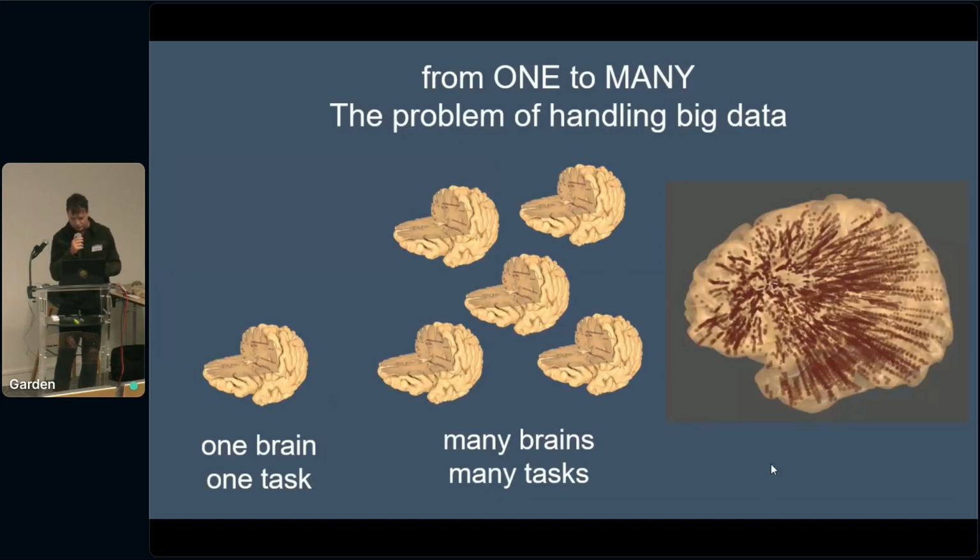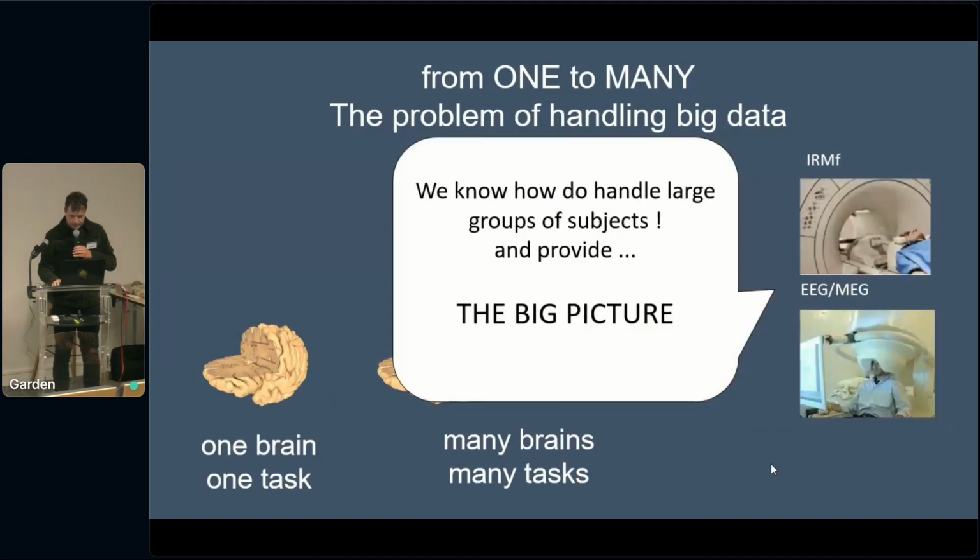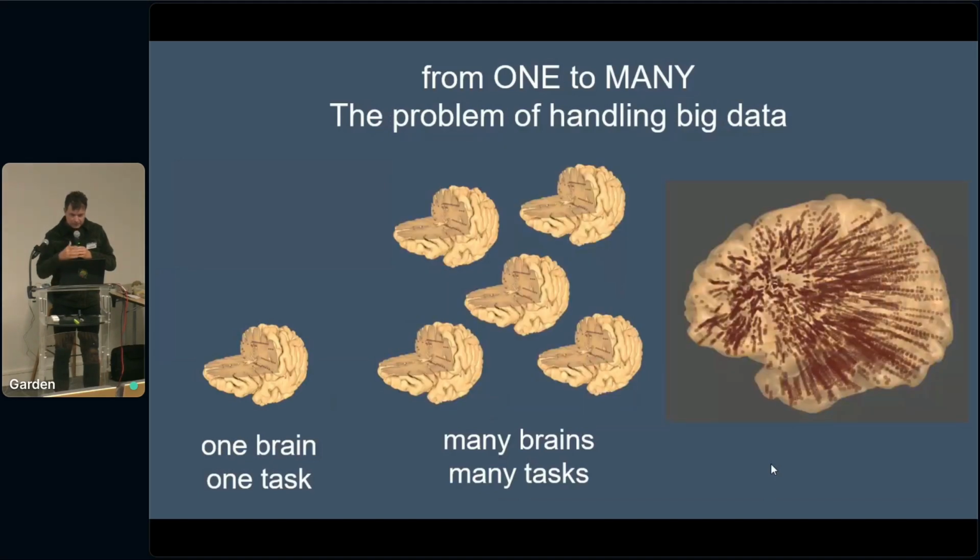Because of course, you also have to know that the position of the electrodes from one patient to the next is variable. So you get all those recording sites that are all over the brain, very variable. You get so many tasks, and what do you do with that? The question is how you stick to your idea of deep dive, of really focusing on one patient and looking exactly in detail at an individual and that particular effect, when you get so much data.